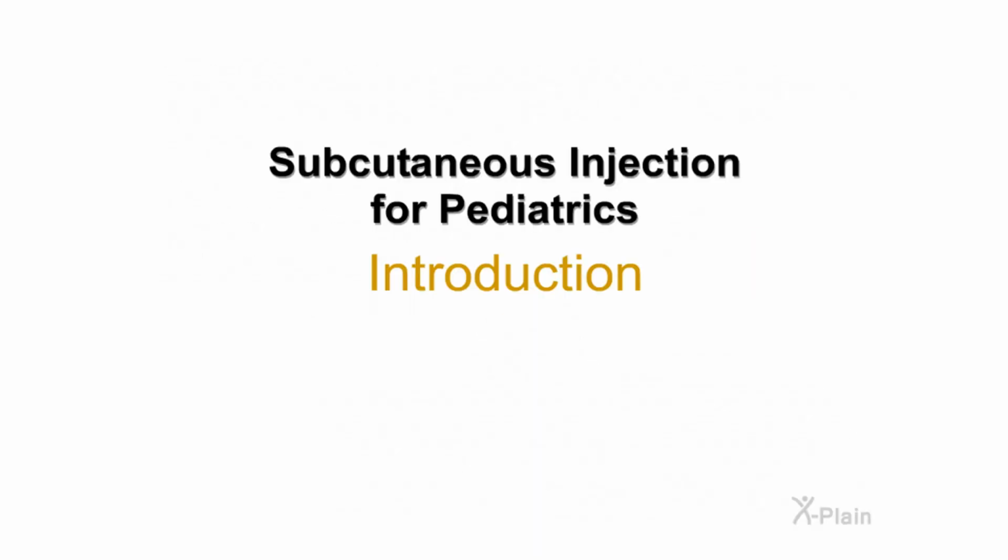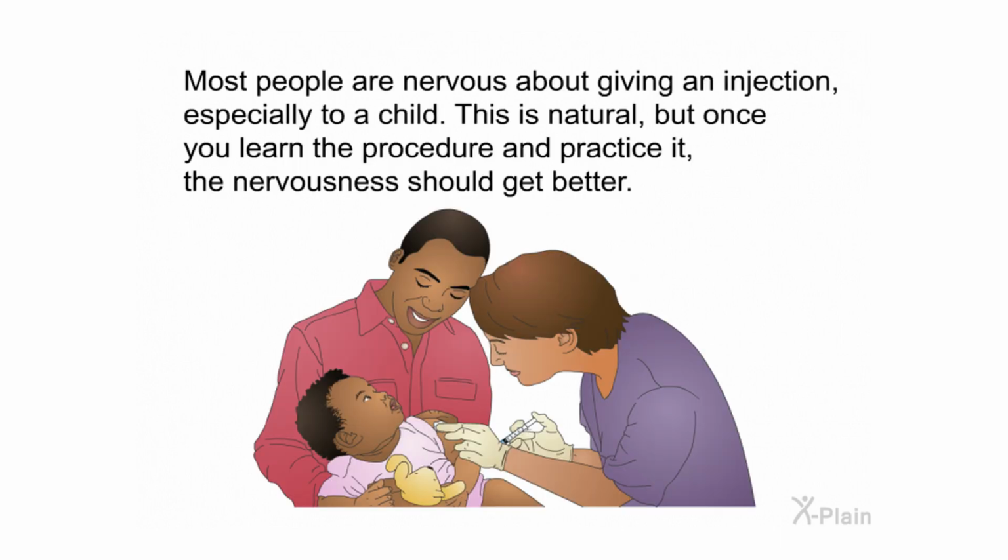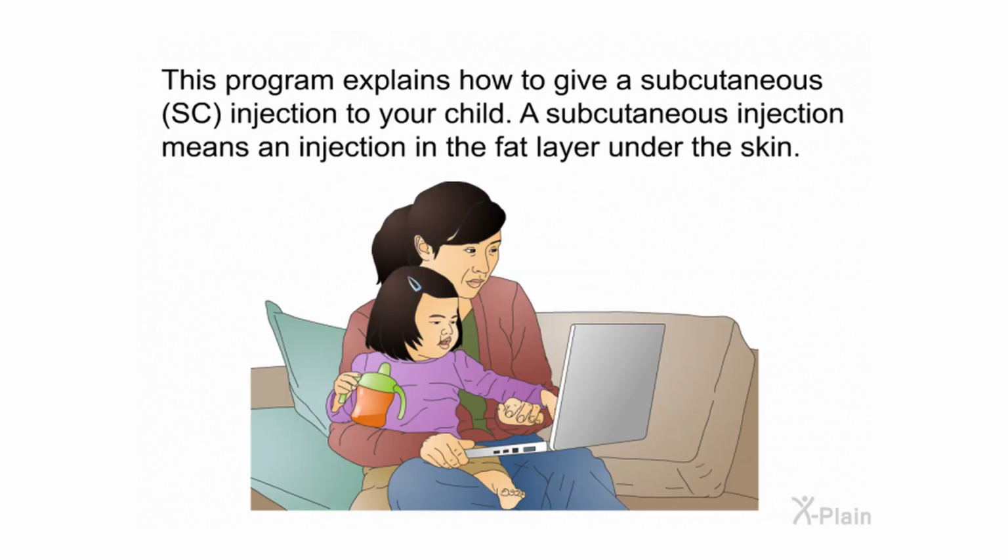Subcutaneous injection for pediatrics. Introduction. Most people are nervous about giving an injection, especially to a child. This is natural, but once you learn the procedure and practice it, the nervousness should get better. This program explains how to give a subcutaneous SC injection to your child.